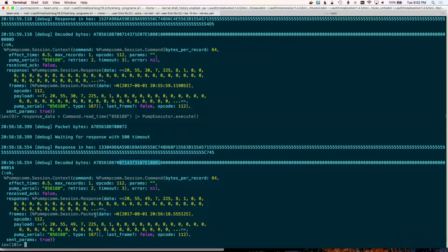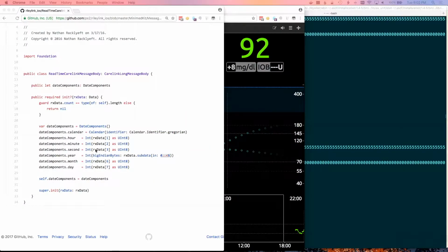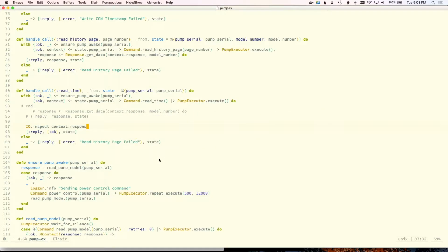All right, so what I have left here, hopefully, is 2, 3, 4, 5, 7. Was that 7 or 8 bytes? 7. Weird. Okay.